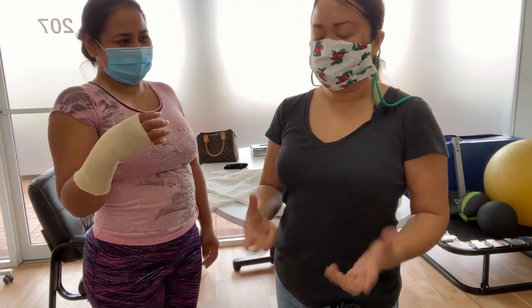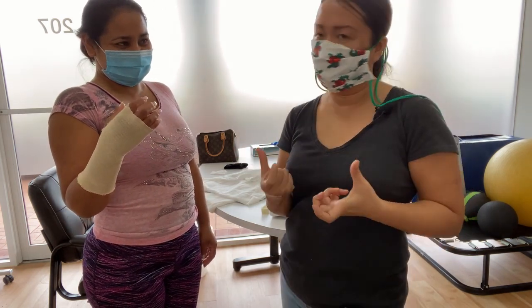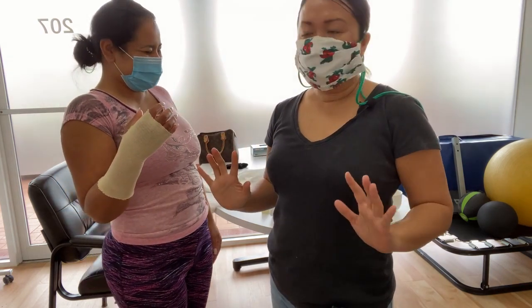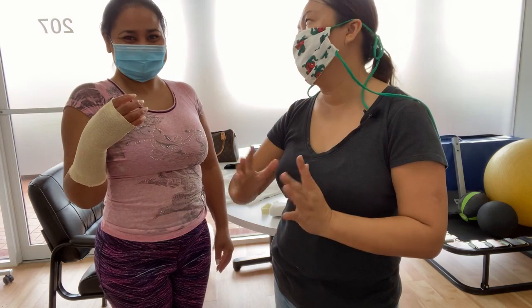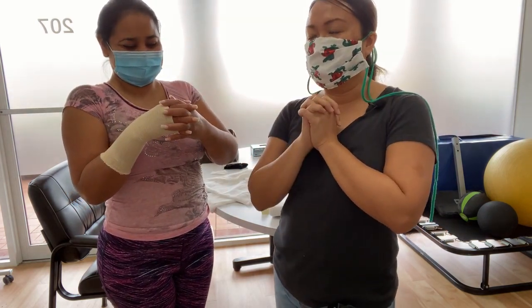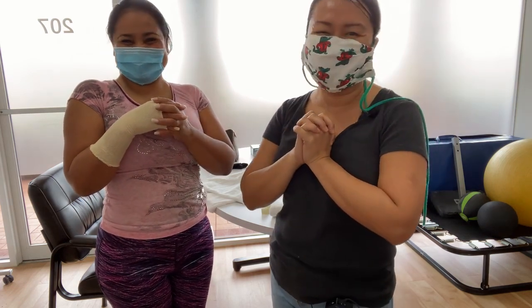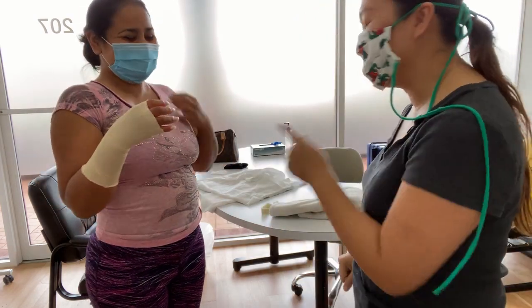But the bad part is that it's squeezing all of the buckets together and just kind of holding the water in the bucket. So we have a little bit of give and a little bit of take. You have to do the stuff in between so that we can empty the buckets. Do you like my analogy of the buckets? That's my perfect one. So that's what you're going to do.